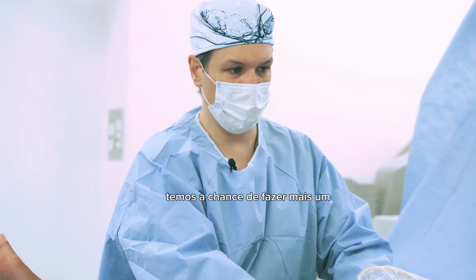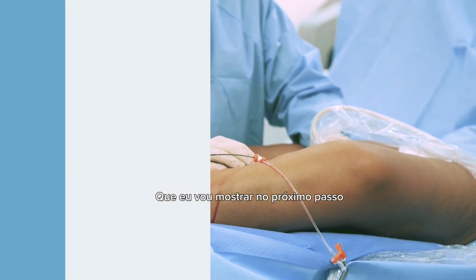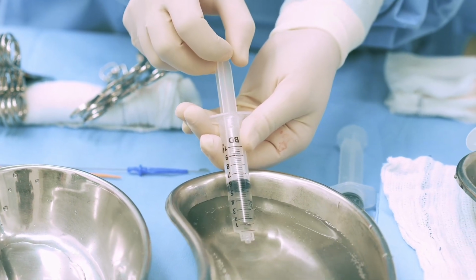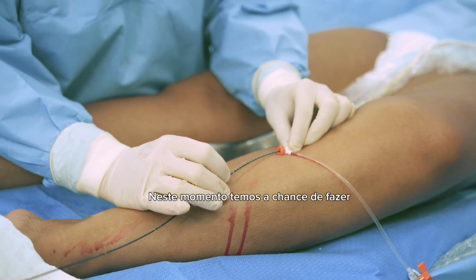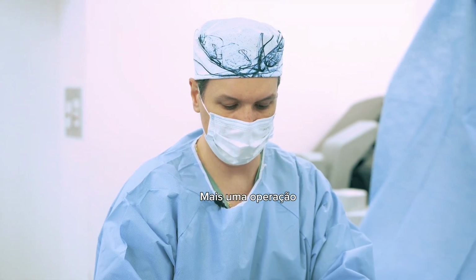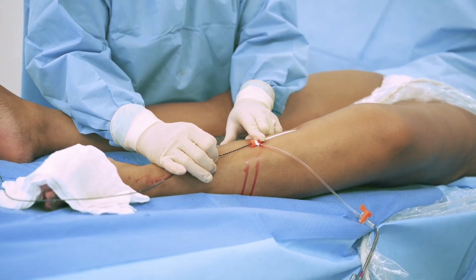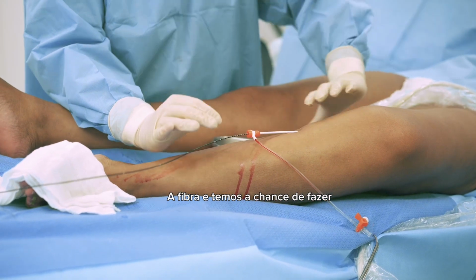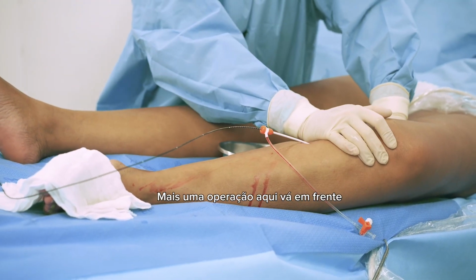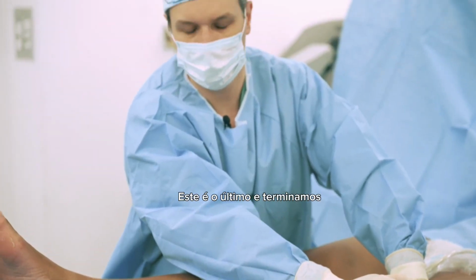We have a chance to do one more, bringing down the sheath, which I'm going to show in the next step. So at this moment, we have a chance to do one more ablation. We bring down the sheath, and then we bring the fiber again, and we have a chance to do one more ablation here. Go on. This is the last one, and we are done.